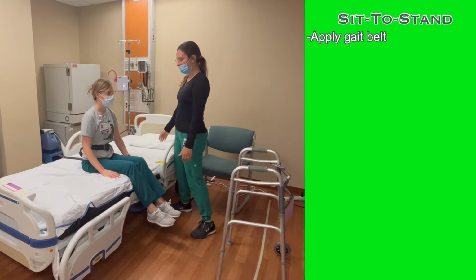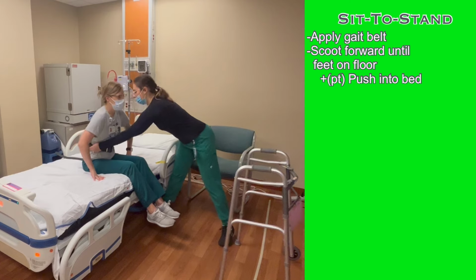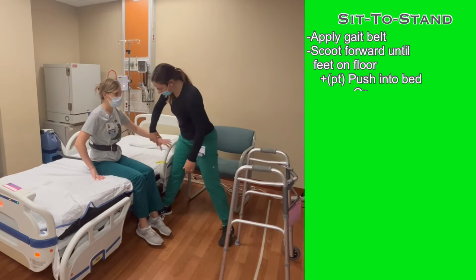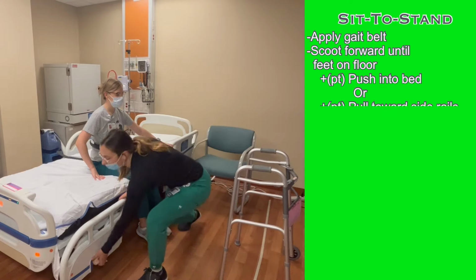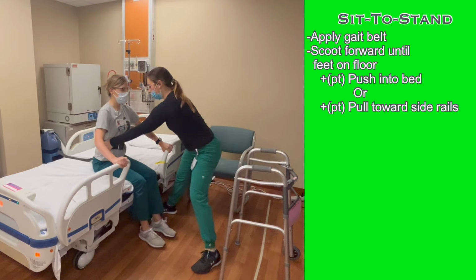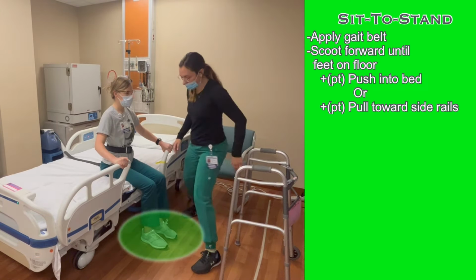With the patient facing the edge of the bed, with feet dangling, instruct the patient to push through the bed and scoot forward until their feet reach the floor. If they have trouble pushing against the bed, but would rather hold the side rails, put both side rails up in a position to leave the gap in the center of the bed, and allow the patient to pull themselves towards the edge of the bed until their feet touch the floor.